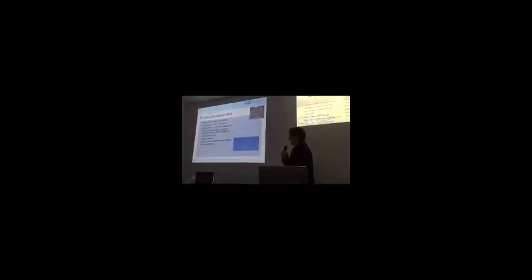I think it's nice if you have angled optics for inspection of the roof of the third ventricle at the end. And well, navigation, if you're not familiar with the approach, navigation might be helpful. And there's a continuous discussion about the ideal entry point.